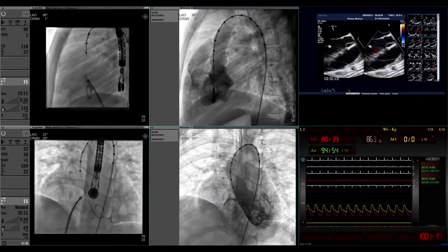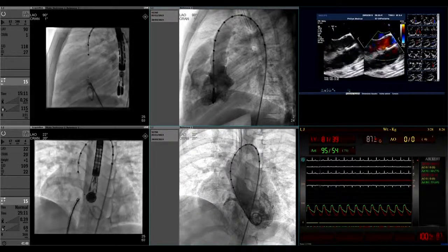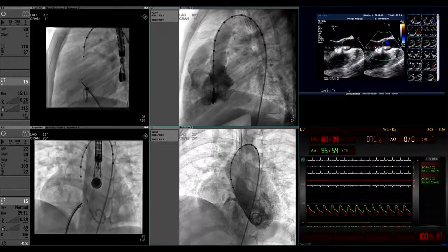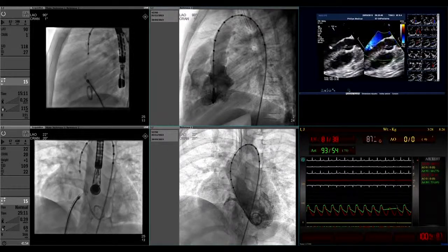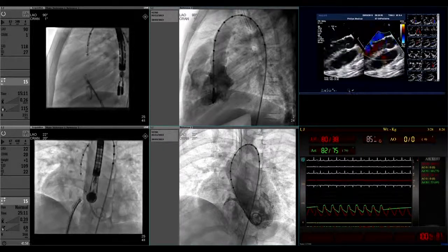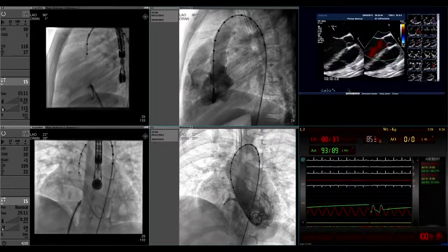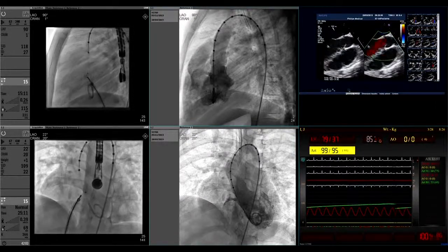Tin, Dr. Dietmar has got a point to make. Hi, Tin. I saw you just 5 minutes ago here, and now you answer from the cath lab. It's unbelievable. I have used it only 3 times: once like Carlos, and 2 times it embolized.